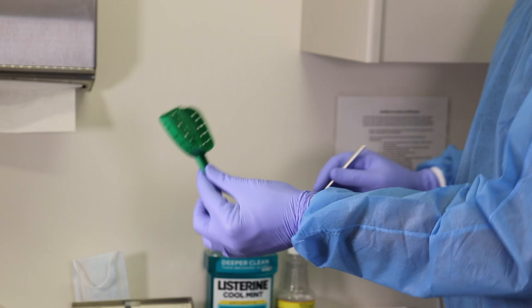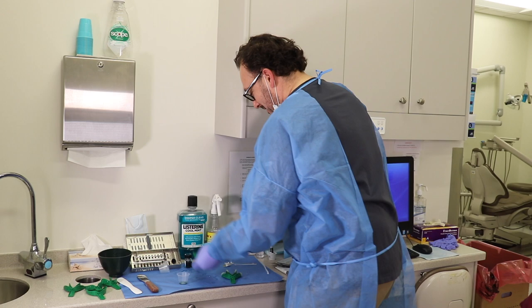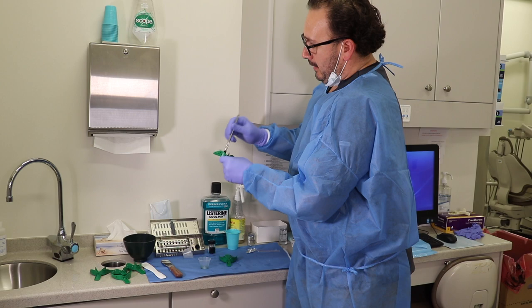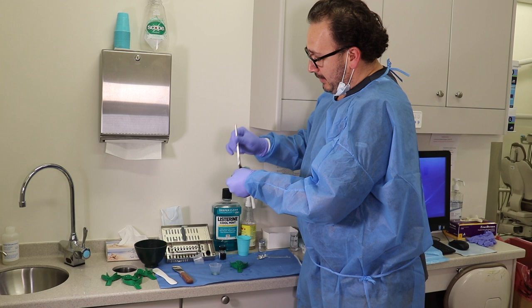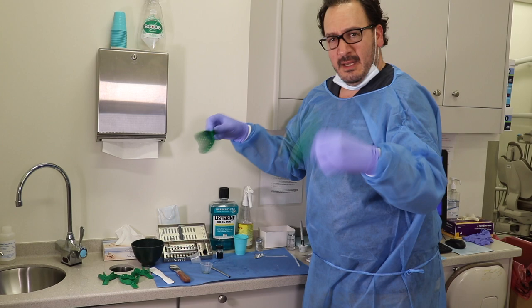Once we do that, then you shake it. And you shake it to dry it out as if it was a Polaroid picture, right? We do this with the upper, and we do this with the lower. In this case, I'm showing the use of the wax. We didn't really need it, but I just wanted to show you how it can be used, okay? Once I have a thin coat of adhesive, we shake it, and we get it done, okay?